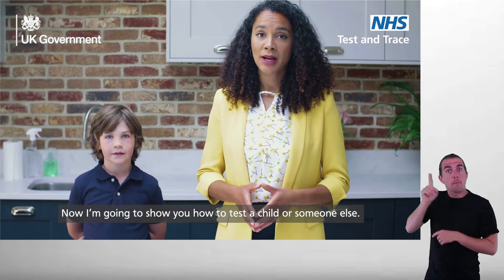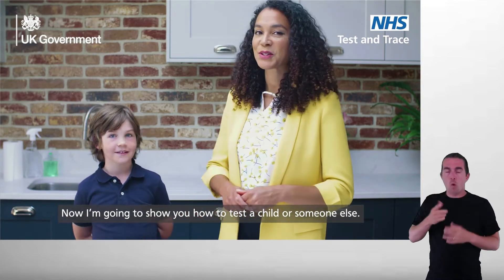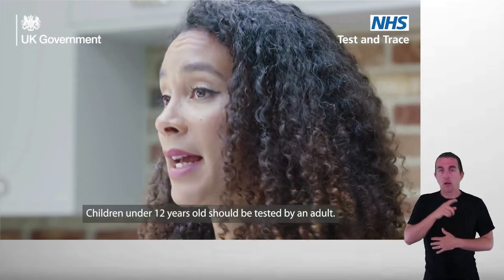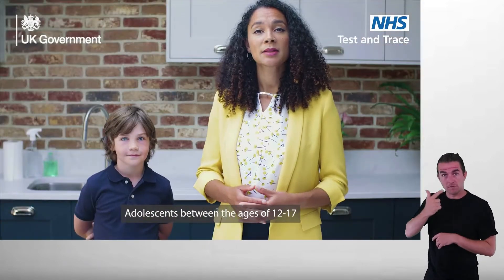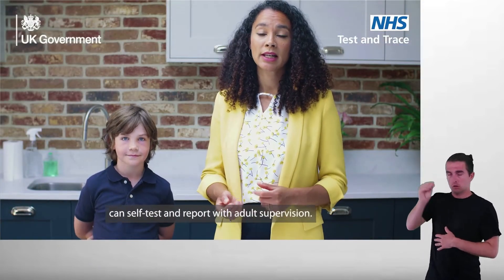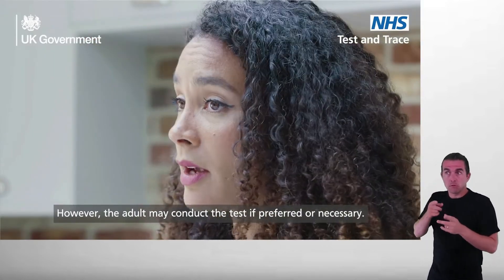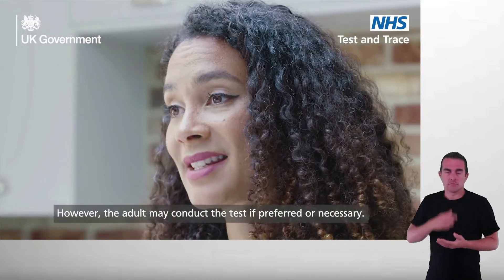Now I'm going to show you how to test a child or someone else. Children under 12 years old should be tested by an adult. Adolescents between the ages of 12 to 17 can self-test and report with adult supervision. However, the adult may conduct the test if preferred or necessary.